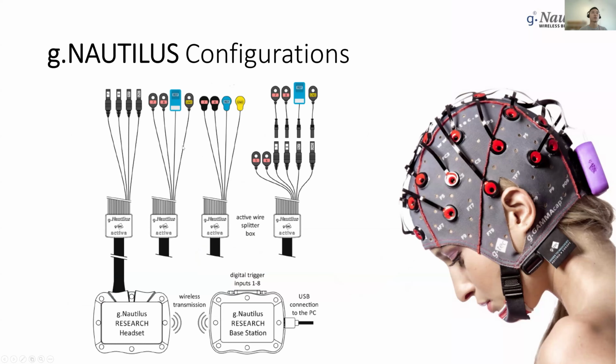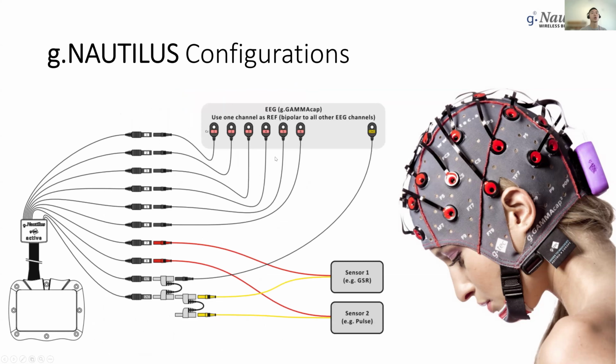One technical image I'm showing here is how you do multiple sensors. Traditional EEG devices have a one-string strand to the electrode itself. But for this multi-purpose version, we have detachable electrodes, as you can see here. You can detach one EEG electrode and attach it to different sensors.